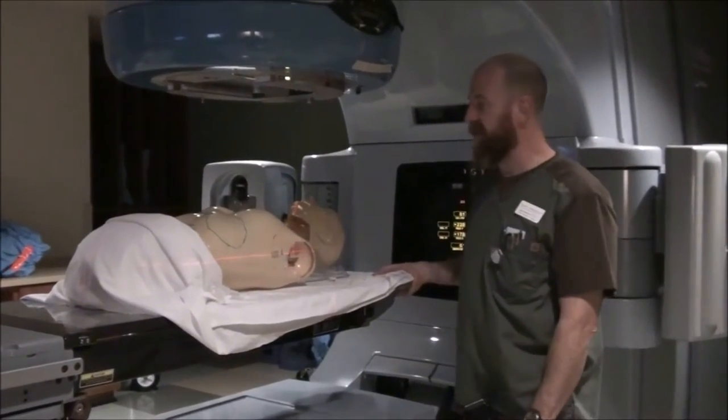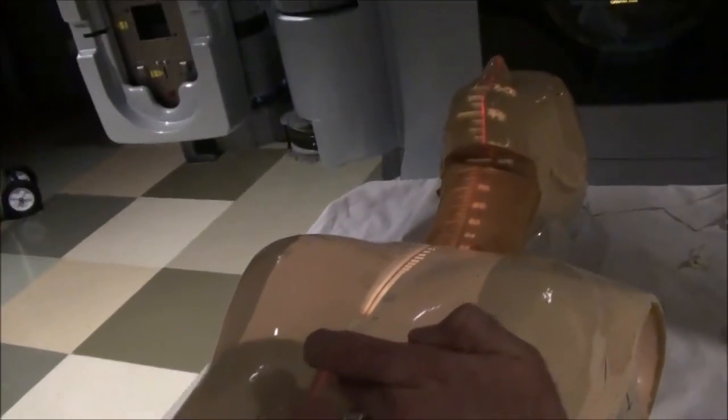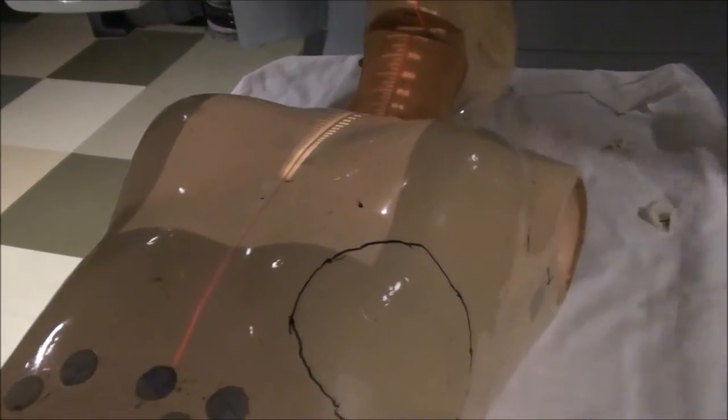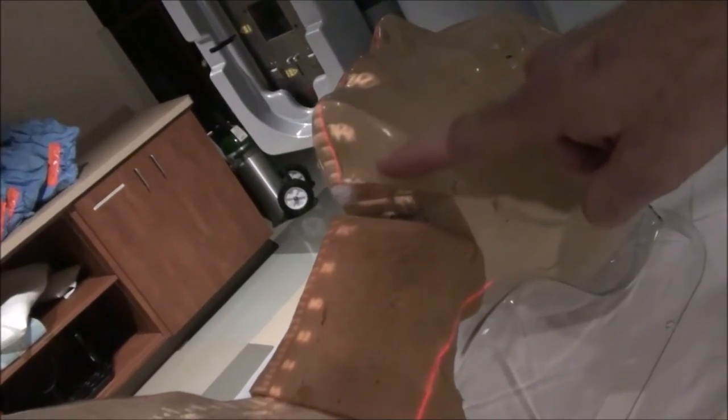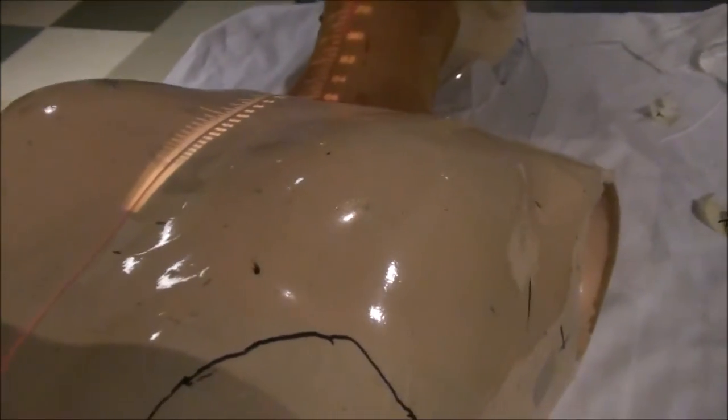The ballpark for the mantle is going to be a little different. You're going to be at or just below the SSN as your CR. Open up the field length so that you're down to about the xiphoid inferiorly, and superiorly you're going to be at about the tip of the chin. The divergence will angle underneath the mandible to get those submandibular lymph nodes, cervical lymph nodes, and supraclavicular. The field width is going to be very wide — over 30 centimeters. We've almost got a 40 by 40 set for her, and that's not unusual.